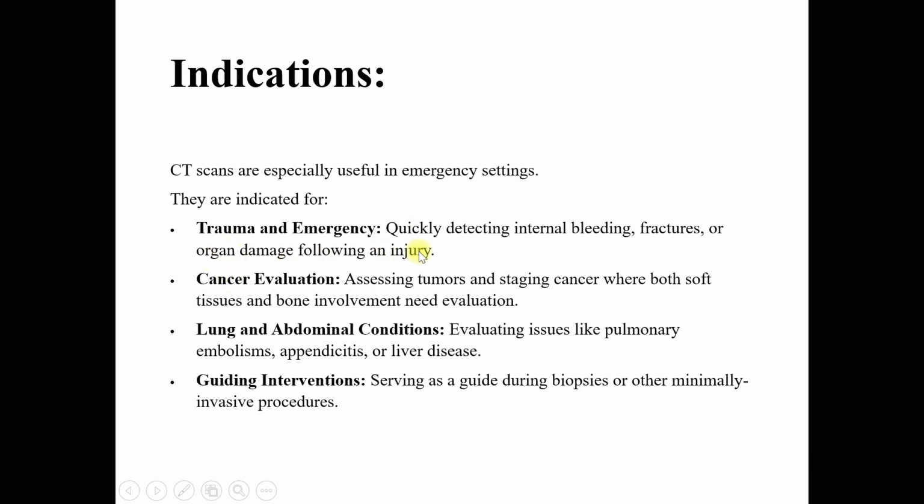So during emergency and trauma conditions, it is better to evaluate the patient by ordering a CT scan.